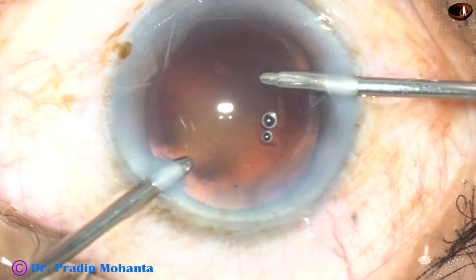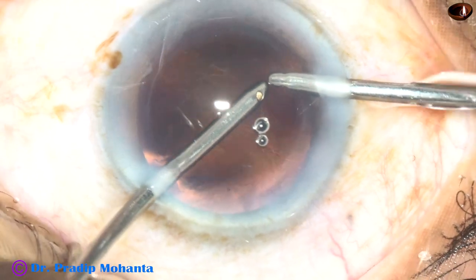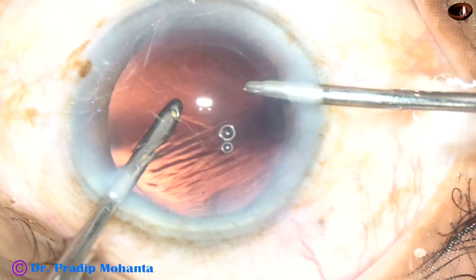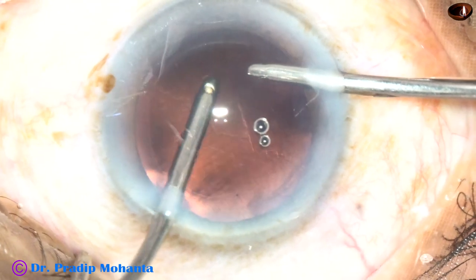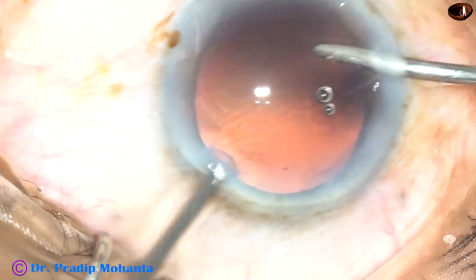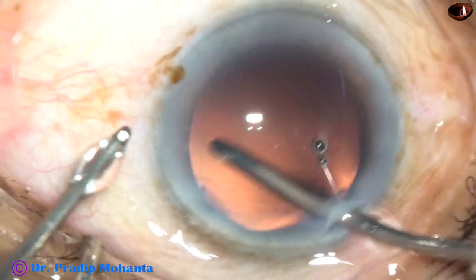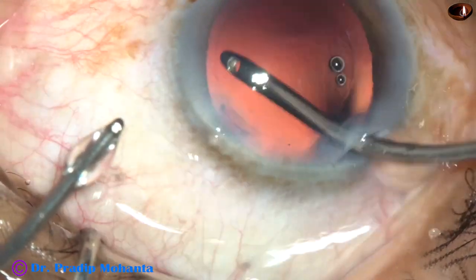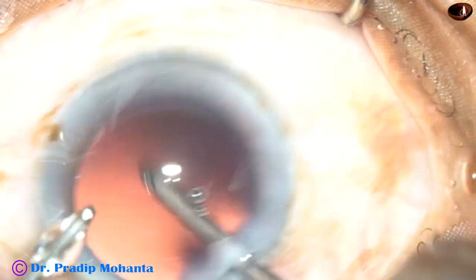Now I am in IA2 mode, and I am doing polishing of the posterior capsule by IA2. Here the vacuum is 30 mmHg and flow rate is 20 ml per minute. And then some hydro polish. The posterior capsule is very clean now.